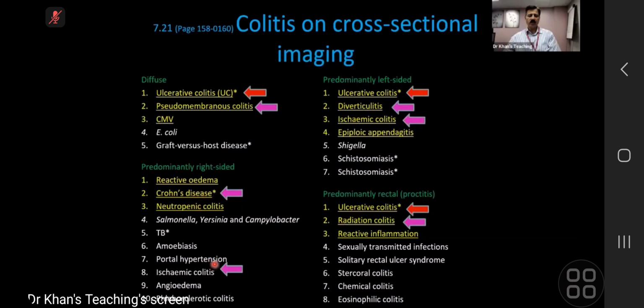Ischemic colitis, this particular type, is an ischemic colitis where the SMA is involved. And if an examiner has this kind of a film, maybe on a CT, he or she is going to show it to you. Why? The concept is that, please remember that SMA supplies till about the transverse colon. So it is supplying the small bowel and the right side of the colon.